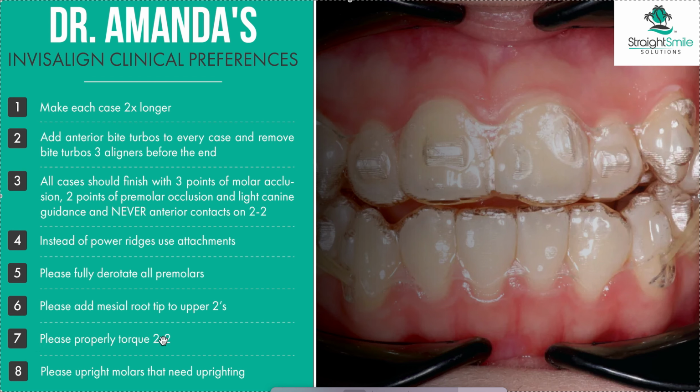No, this is not going to be in my clinical preferences, but so often, especially in a case like this, you're going to have to ask for torque on this. So just be ready to ask for it. And a lot of times you guys are looking at cases and you're like, I don't know what's wrong with it. It just doesn't look that good. Well, it's because they didn't do the torque.